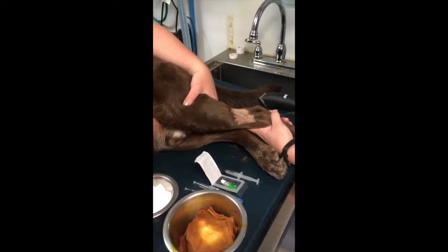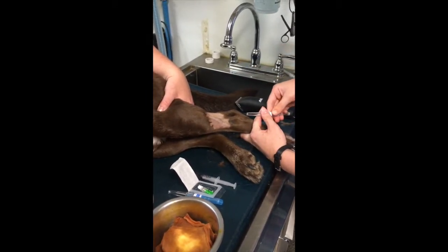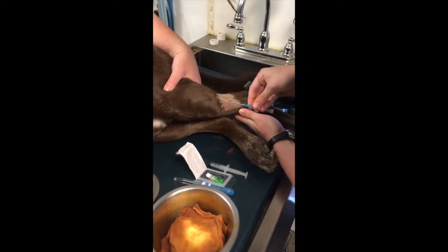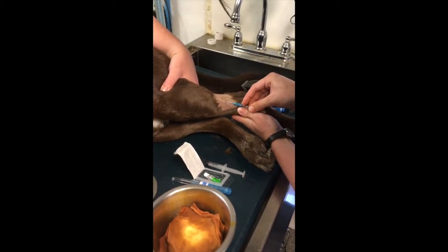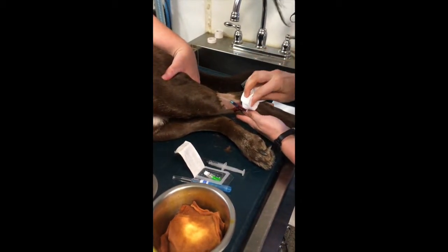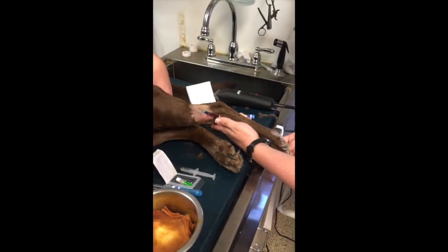All right, now that I have it nice and scrubbed, I'm going to go ahead and take my catheter. Okay, I want to make sure that the bevel side of the catheter stylet is up. I'm going to go ahead and advance my stylet, my catheter. So once I have a flash in the stylet, I'm going to go ahead and advance the catheter. Make sure that my sharps are out of the way. Take a little piece of gauze, just dab up the blood. We don't want that inside of our tape. Okay. Once that is done, I'm going to go ahead and secure the catheter.